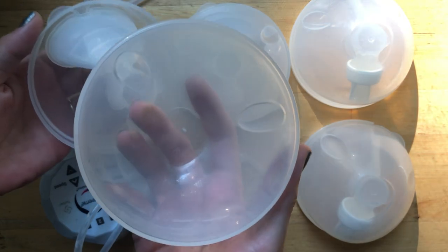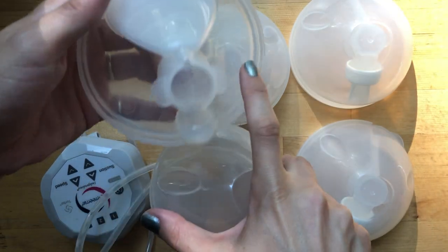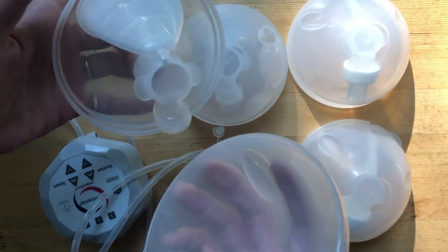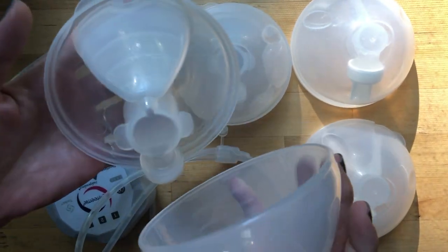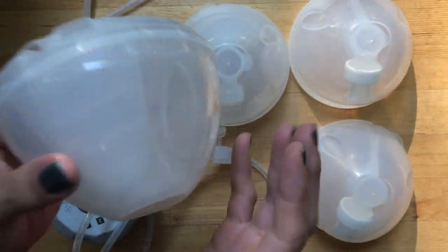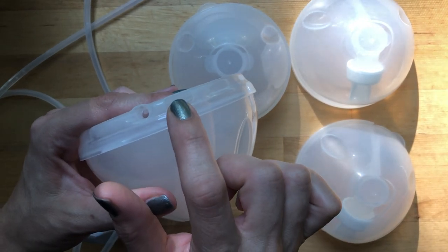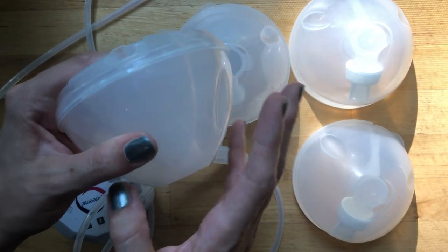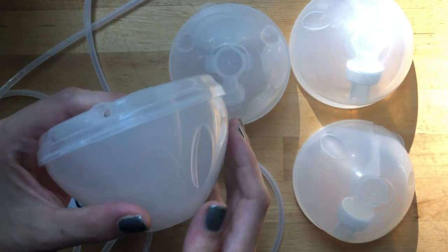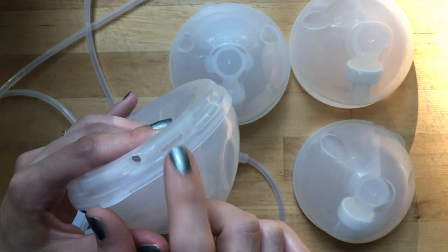I'm going to pop this open to show you the components. There's the cup where the milk is stored. A lot of people wonder - since there's no rubber stopper around the side rim - whether milk will spill out the bottom. The answer is no. I've actually had milk spill out the top from this little hole, because I would bend over too far picking something up or putting my son or daughter in a car seat, so you do have to watch how far you bend.